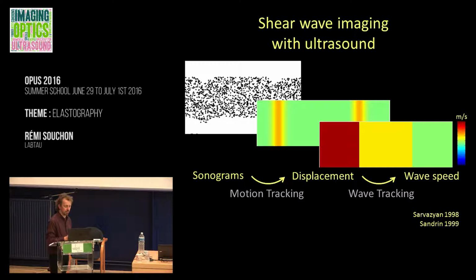And if you look carefully, you will see that they initially propagate at the same speed, but then there's some change in propagation speed. And now you're aware that this is exactly what we're after. We're after all these changes in propagation speed. But it's clearly not easy to see in this image.